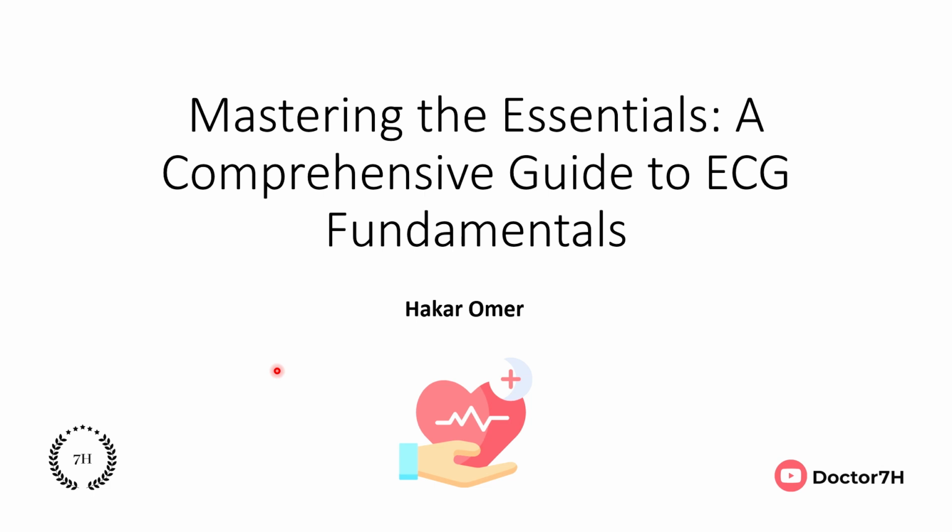Today I'll be talking about the ECG basics, and I can promise that by the end of this video you have mastered all the ECG basics and essential information that you need. In another word, I can also say that this video is kinda like a summary of the first 100 pages of the only ECG book you will ever need. There's such a book, you can check it up.